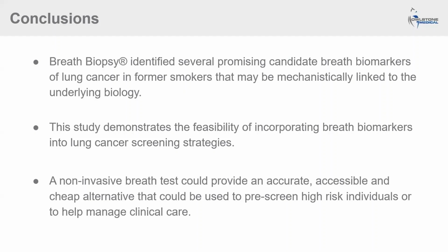One recommendation is to increase the study power, and power calculations based on the current data set show that a minimum of 40 to 50 subjects per group would be beneficial. Moreover, any follow-on study that utilizes Owlstone Medical's OMNI assay will benefit from the high-resolution accurate mass platform and a growing spectral library of standards.